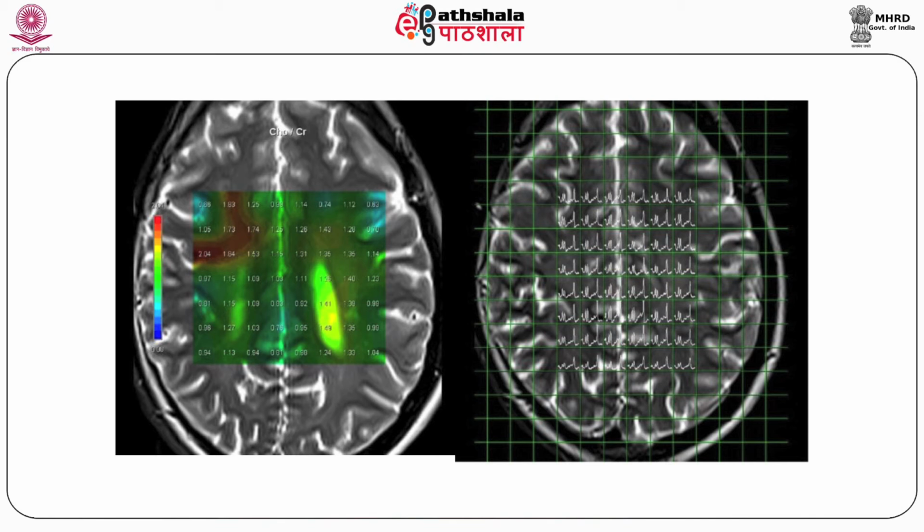This can be done by two methods. One is CHESS, chemical shift selective excitation, most frequently used technique. Water signal is eliminated using one or more 90-degree pre-saturation pulses centered over water resonance frequency, or we can use a water elimination Fourier transform technique where a 180-degree pulse is centered over water. This is slightly less efficient than CHESS for water suppression.